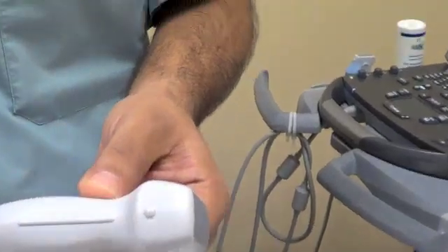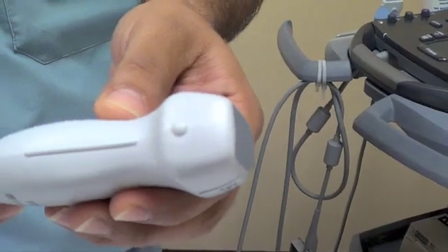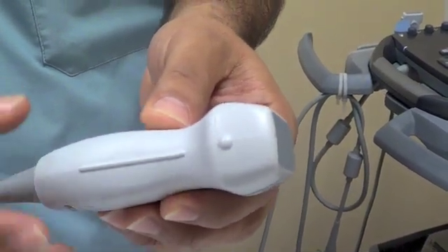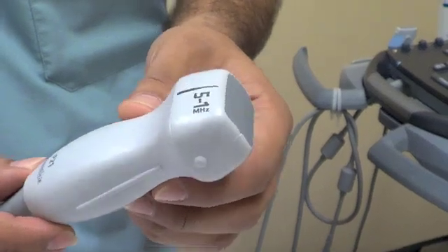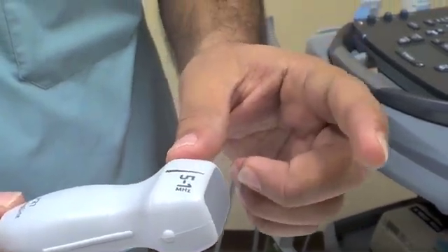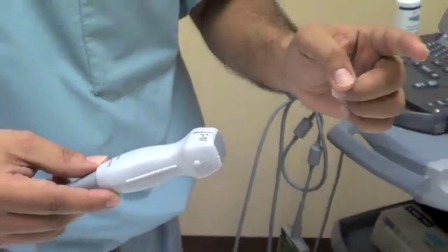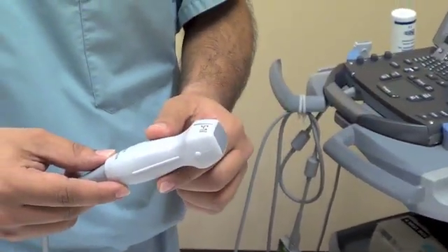Again, you can see it has a probe marker, and as you'll see in other videos, it will tell you the proper position of the probe marker — so it's very important to know where the marker is. This probe has a lower frequency, which results in higher penetration but lower resolution in the image.